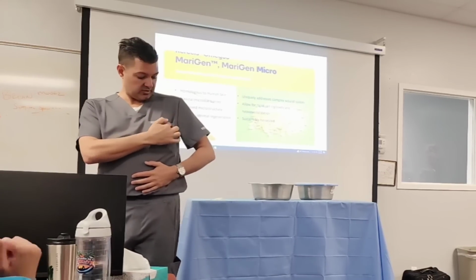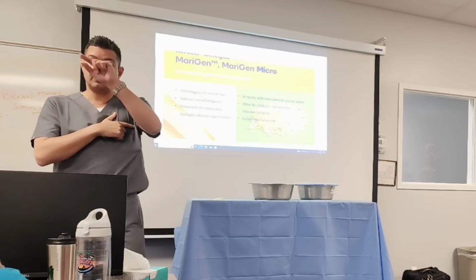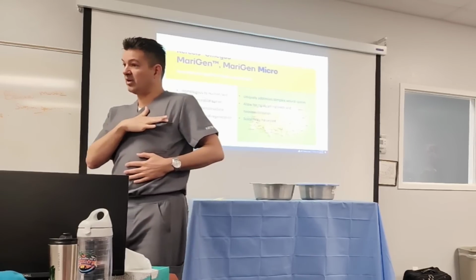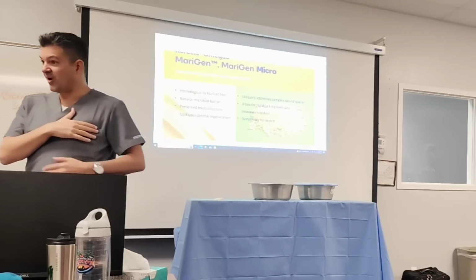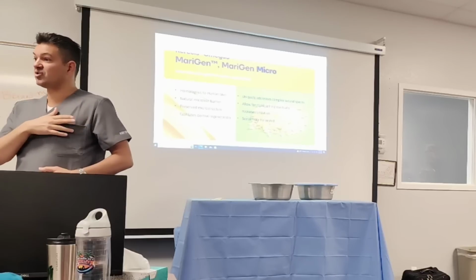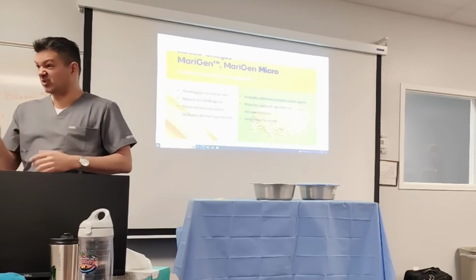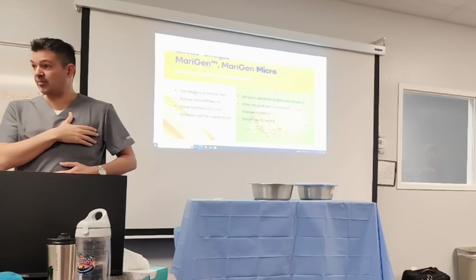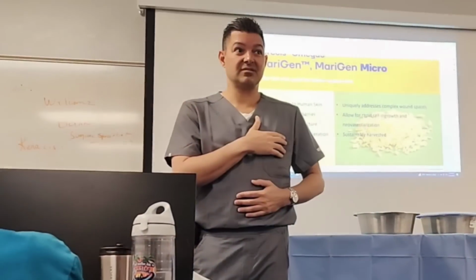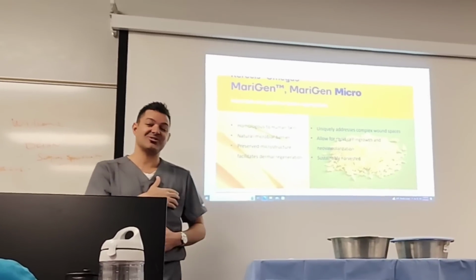What we're doing is putting a 3x7 piece of Surgibind with the fenestrated piece laying right over here, right under the suture line. That's creating less scarring, so you don't have as bad a scar as you typically would have, because of the incorporation aspect and the properties in that. It's a real wow factor. Yeah, so we're just starting that.